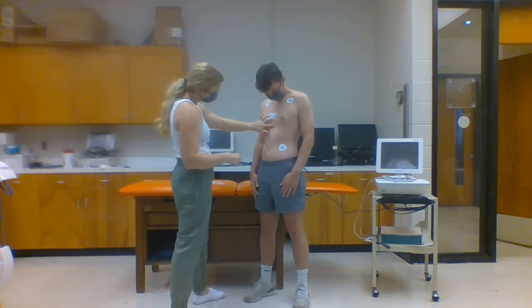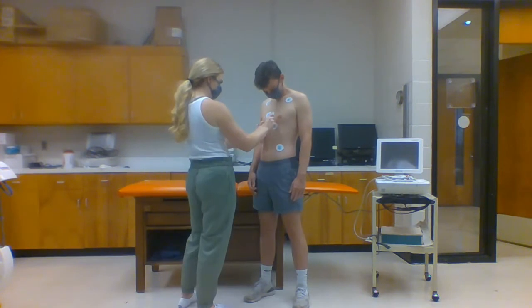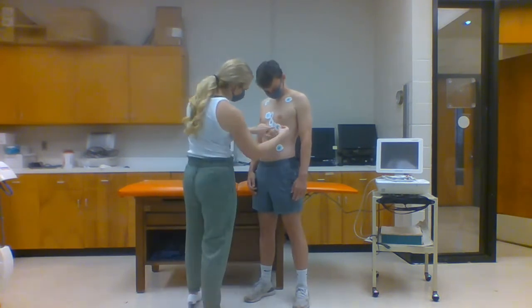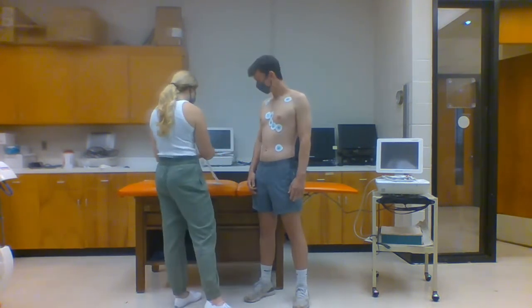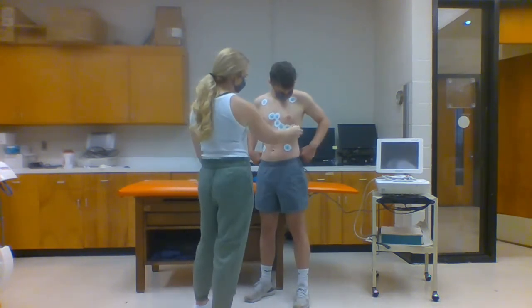The limb leads give us 6 different views of the heart in a frontal plane, whereas the 6 chest leads give us 6 views of the heart in the transverse plane. The tracings from each lead tell us the direction of the electrical activity occurring in the myocytes when depolarization, plateau, and repolarization occur.